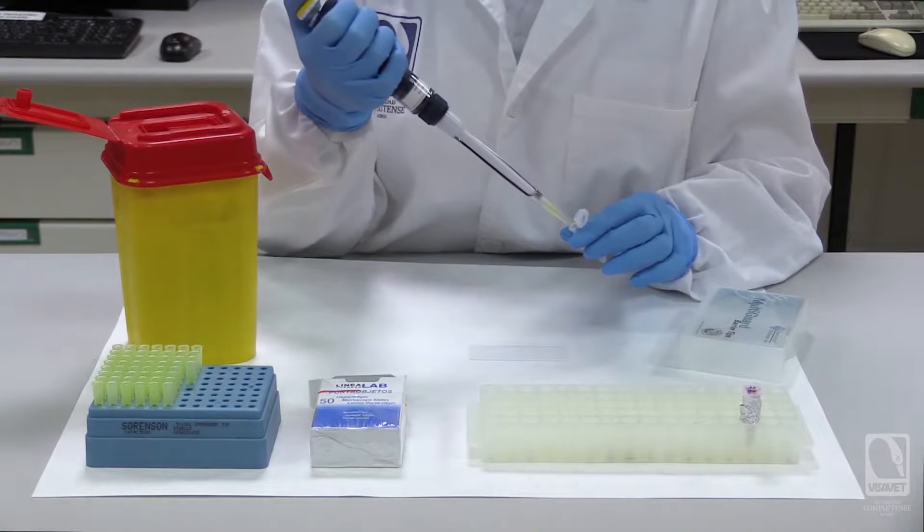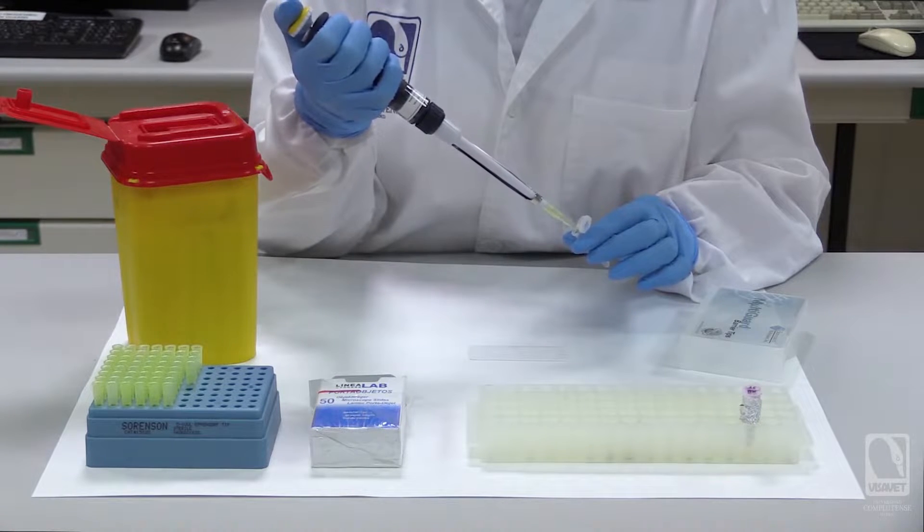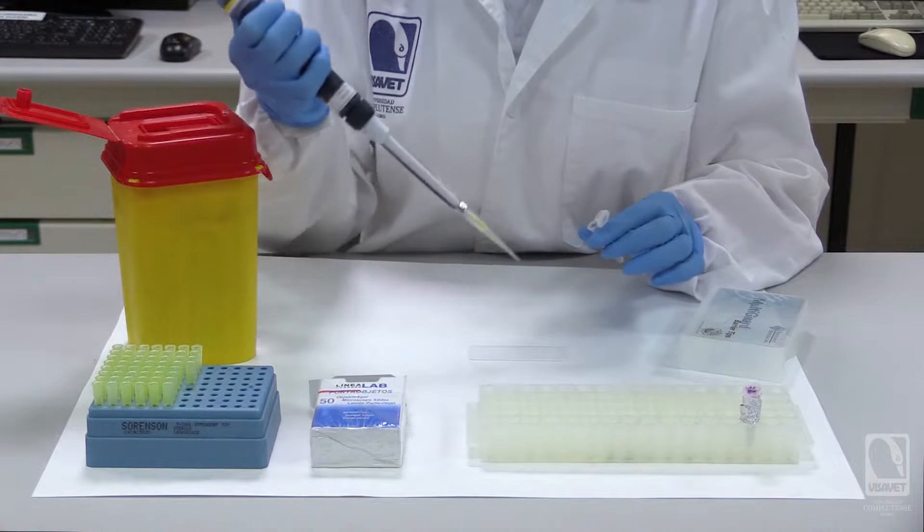The next step involves thorough homogenization of the serum by repeatedly moving the micropipette up and down. Once the homogenization is complete, we will carefully place a droplet of the homogenized serum onto the slide.